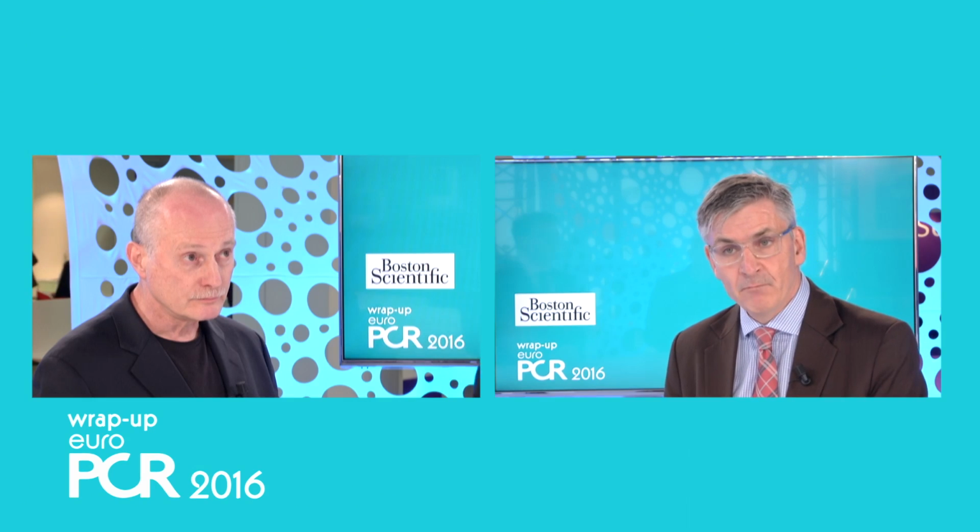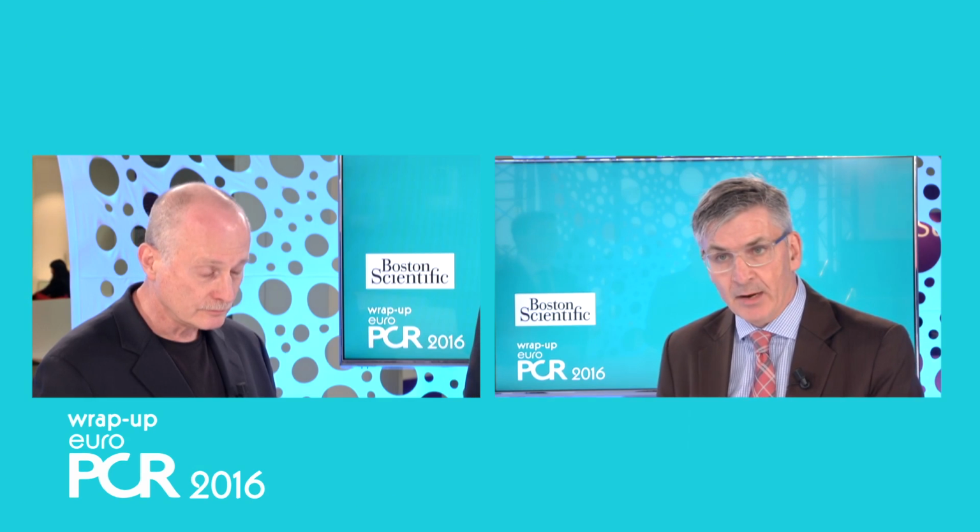The biggest differentiator in terms of a negative that we've seen with the Lotus trials is a relatively high pacemaker rate in the 28 to 30% range. So the Lotus valve is maybe the valve which has the lowest PVL rate on the market, but on the other hand, Matthias, the pacemaker rate, at least in the initial report, was pretty high. How is it looking today? Has anything changed? Any techniques to bring it down?